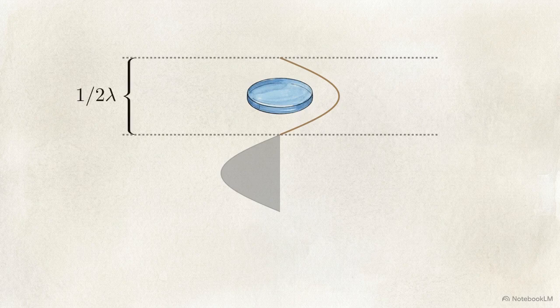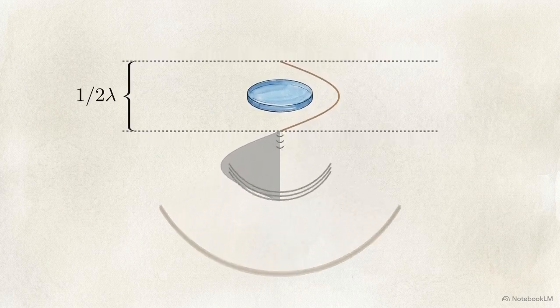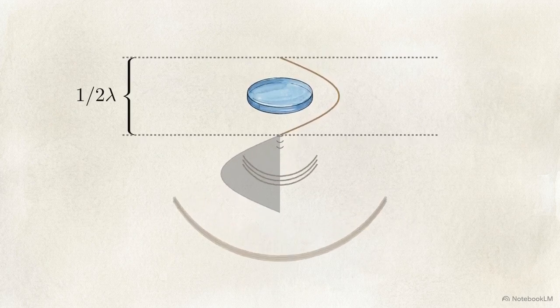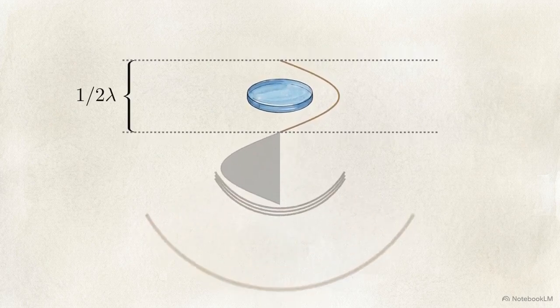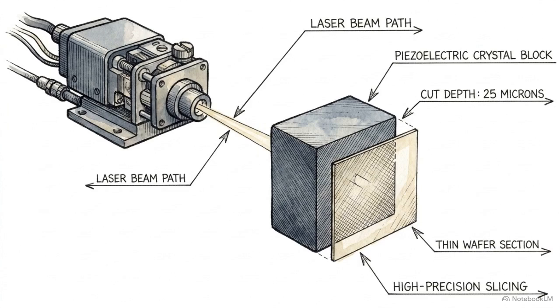A transducer produces maximum output when the acoustic wavelength is exactly twice the thickness of the piezoelectric disc. Here, exactly 1/2 of the wave fits within the disc. As the material pulses, it reinforces the emitted waves because this specific thickness forces them exactly in phase. This means a sonographer's choice of frequency is hard-coded into the hardware. The crystals are physically cut to exactly half the thickness of their target wavelength.